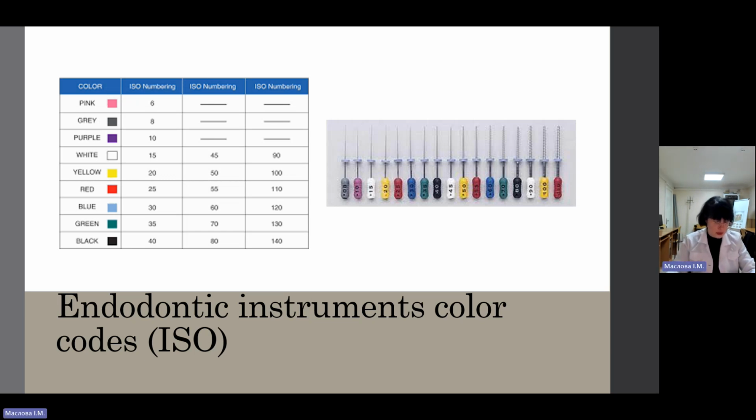And generally, the principles of root canal treatment consist of thorough cleaning, adequate shaping, and complete filling of the root canal system. In order to accomplish these objectives, many different instruments are available. Some of the instruments are common to all branches of dentistry, while others have been modified or specifically designed for endodontics. Endodontic instruments are standardized by the ISO, the International Standards Organization, for the unification of instruments.